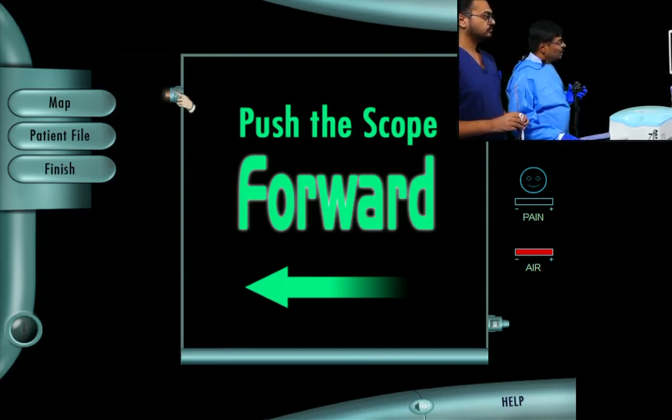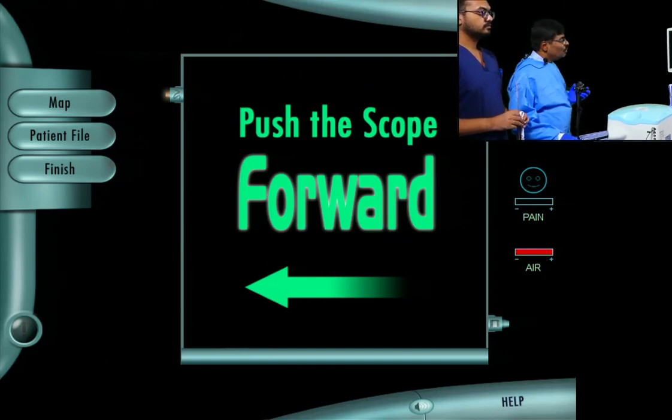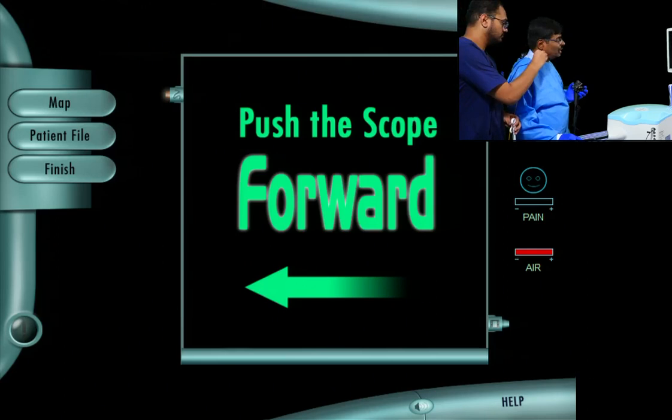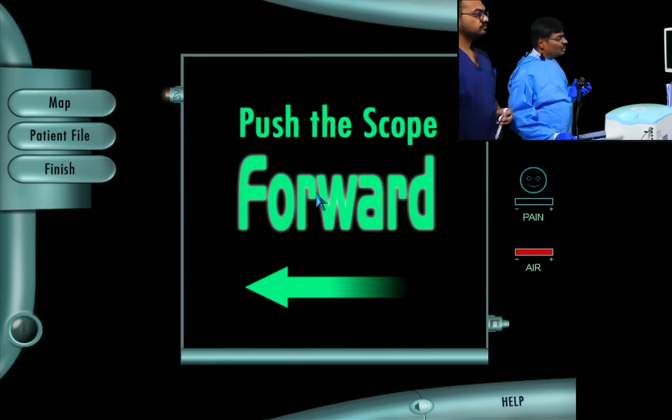Just imagine the monitor in front of you. It will show the patient file and the map, which tells you the geography and gives you an idea about the case, the patient's pain score, and how much insertion you have done. All the information is built in. So, it is a real-life feeling when you do it. For a little haptics, I think this is a near perfect scope, I would say. So, let us start doing what I call a diagnostic colonoscopy.